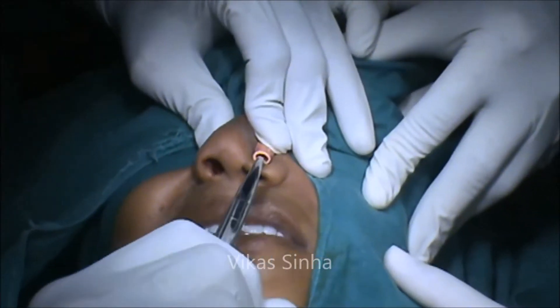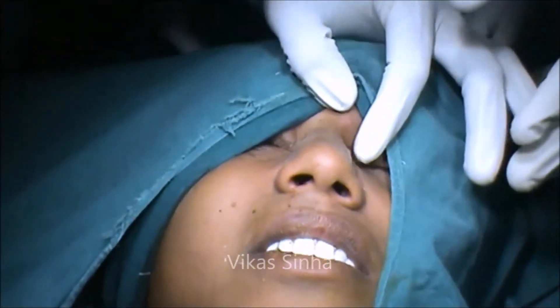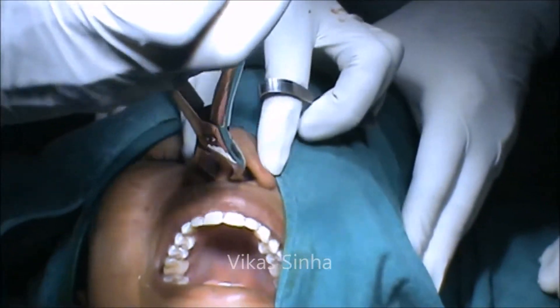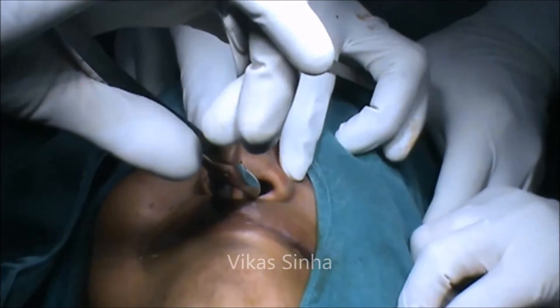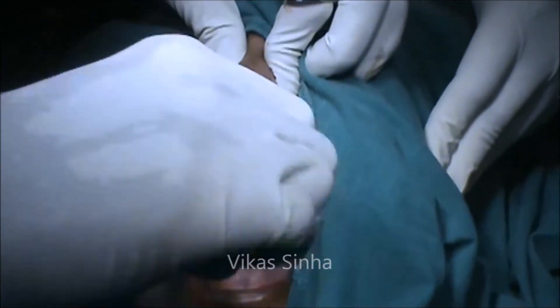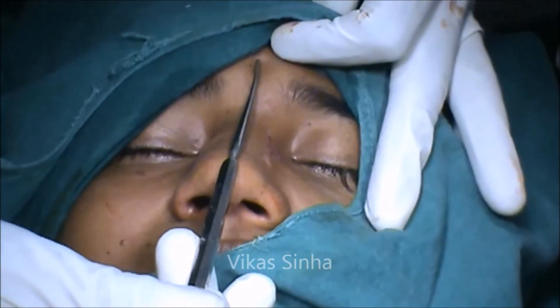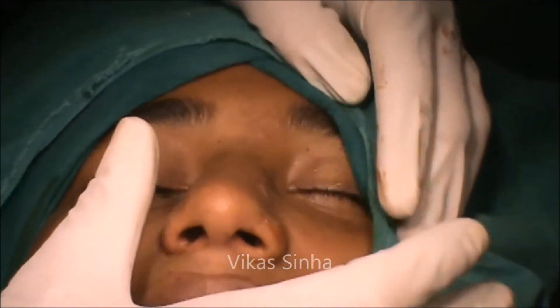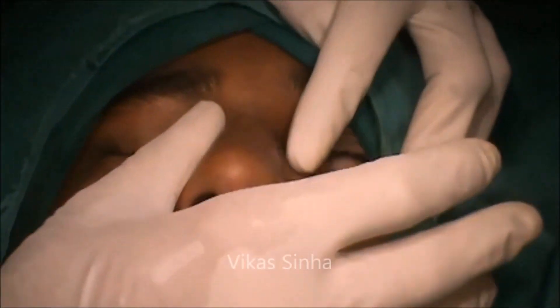The basic principle is to increase the deformity, then decrease it. And with the Ash's forcep, I lift up the nasal septum for the alignment of the septum. This is a painful step. Now you can see that the nasal bone has been aligned. The final distal manipulation is required for the final alignment of the nasal bones.